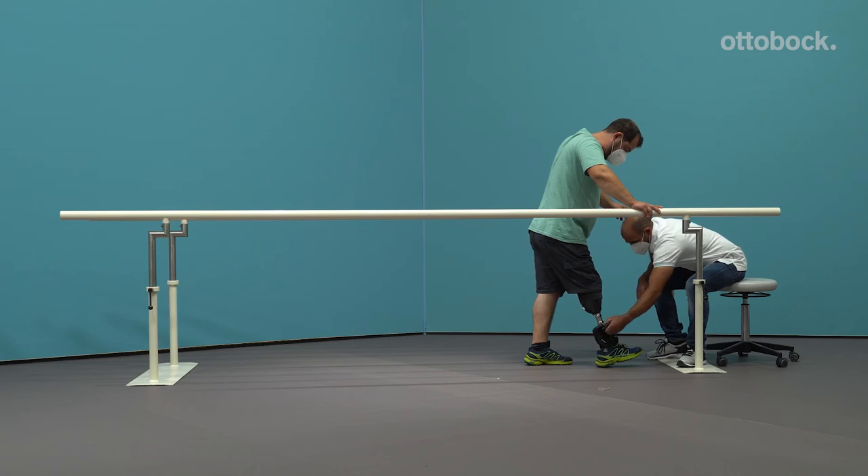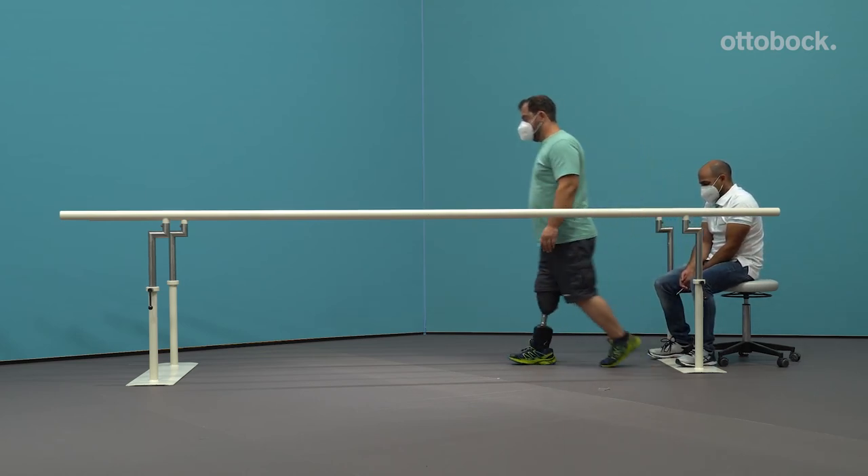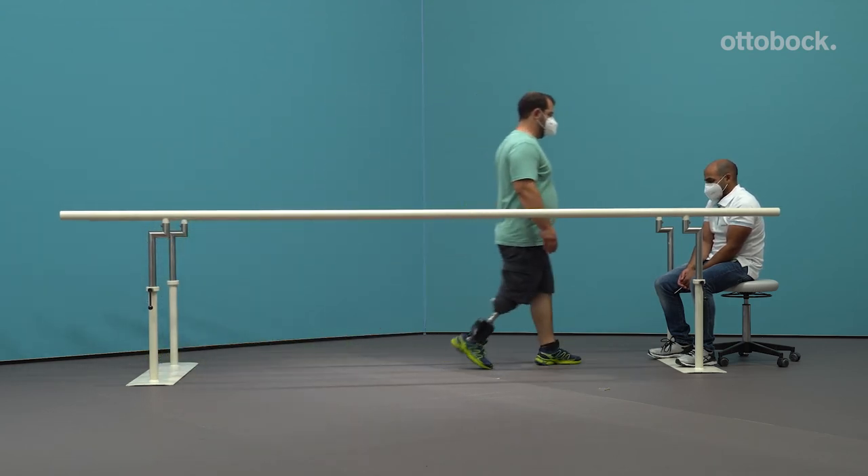Is there an excessive valgus moment at the end of the mid stance phase? If yes, move the prosthetic foot in the medial direction. Note: adjust the external rotation so that the foot's inside edge of the shoe is parallel to the line of progression.